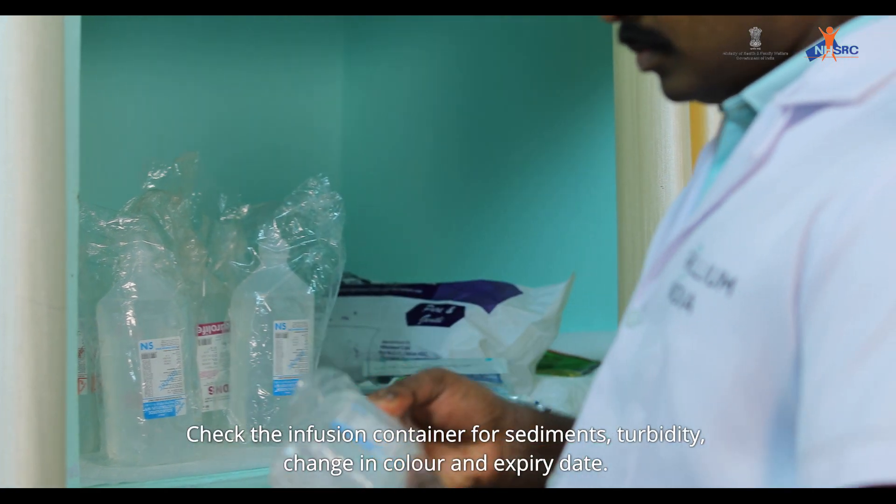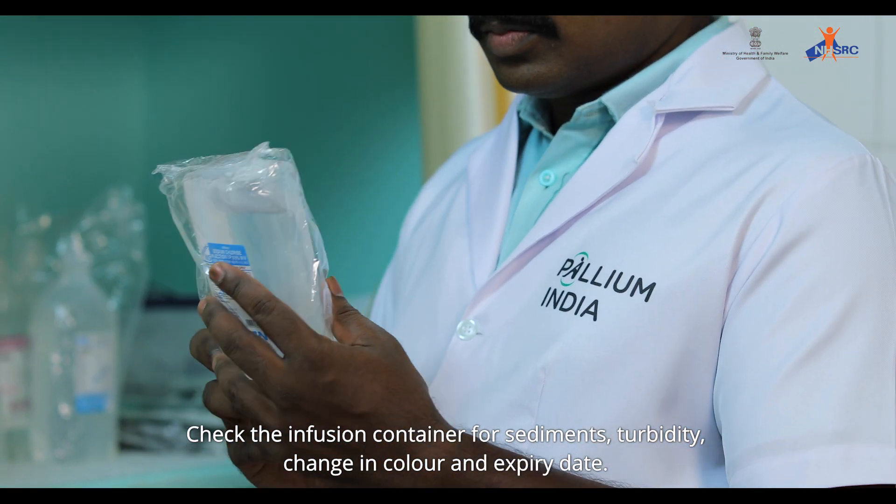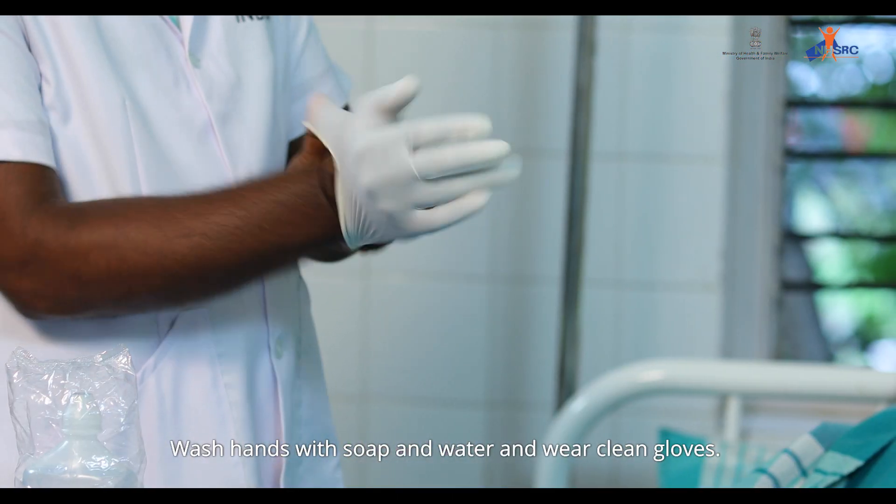Check the IV solution. Check the infusion container for sediments, turbidity, change in color, and expiry date. Wash hands with soap and water and wear clean gloves.